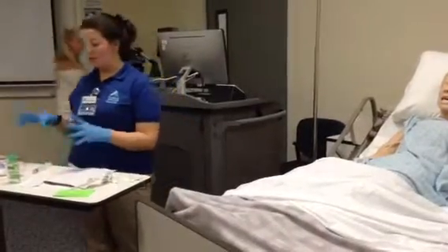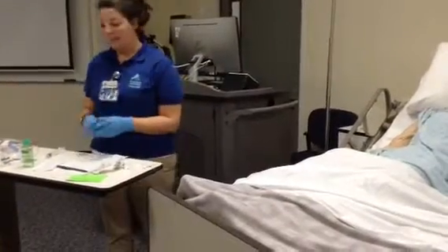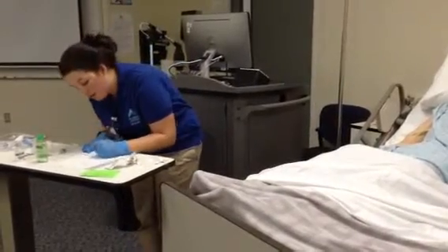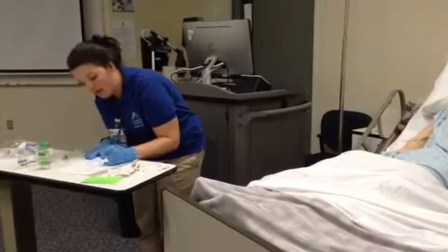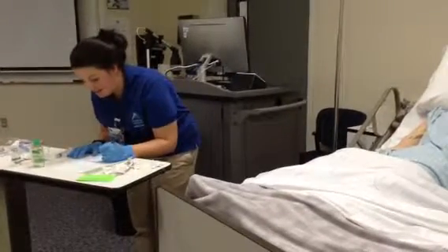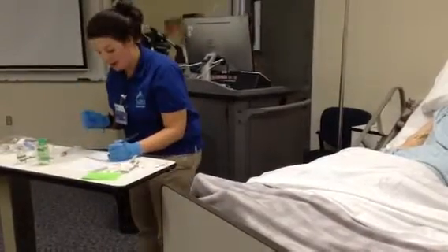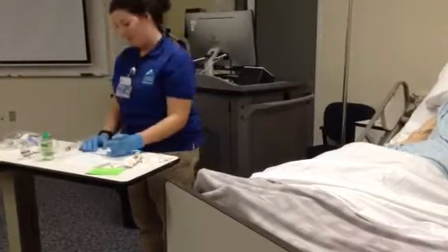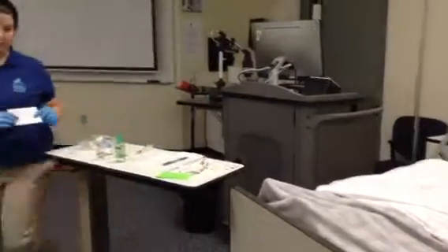At this point, I would dispose of all my needles, make sure all my sharps are taken care of, make sure my patient's comfortable, that he doesn't need anything else, and I would document. In my documentation, I would document that I did use the MAR to verify my medication. It was at 0300, vancomycin, 500 milligrams, peripheral IV, no phlebitis, redness, swelling, or inflammation, no infiltration of the IV site, 50 milliliters of fluid used to deliver the medication in the mini bag. I would record my intake and output, and this is my documentation.